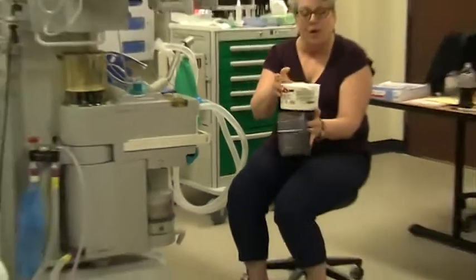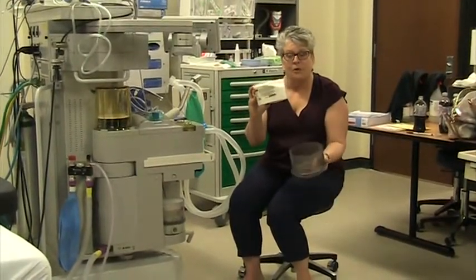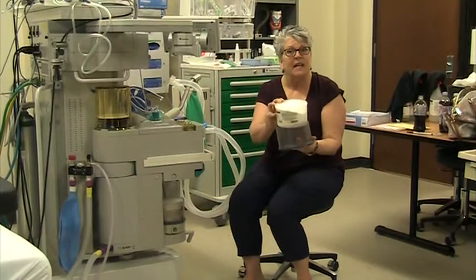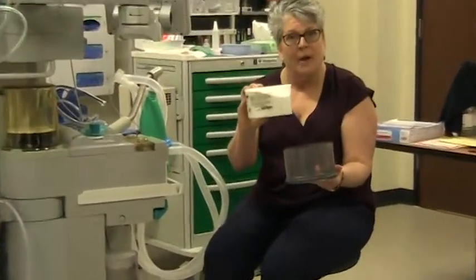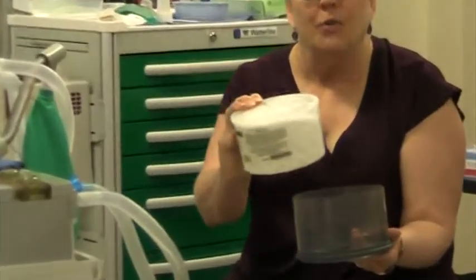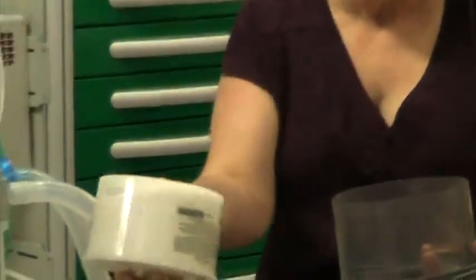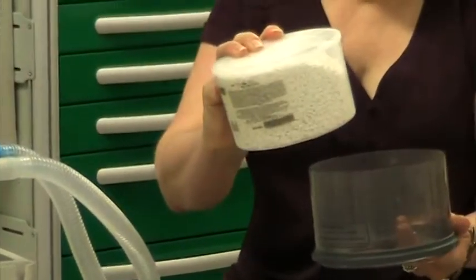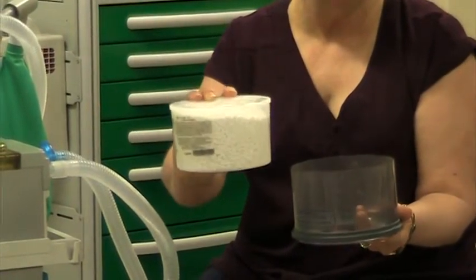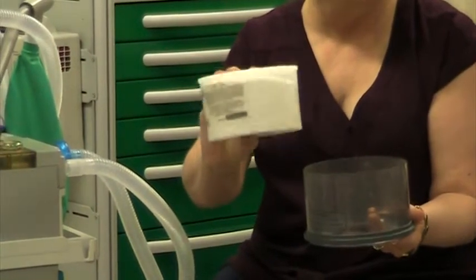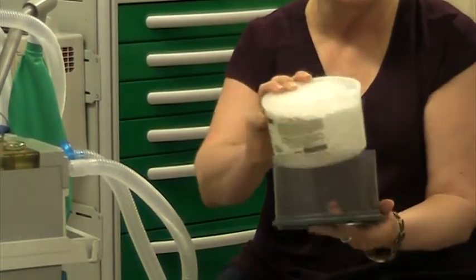This machine takes canisters of CO2 absorbent which fit into the receptacle. When you unwrap this from the package, you need to shake it over a trash can to get out the extra dust and stuff. We do not want this going into the patient's lungs.